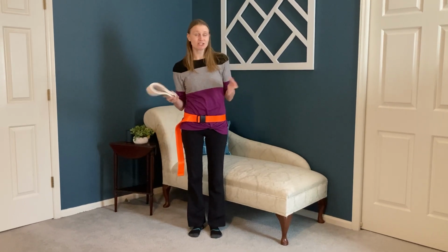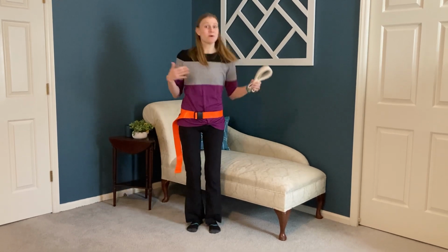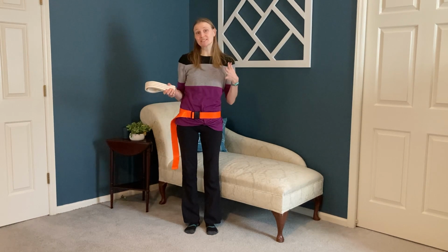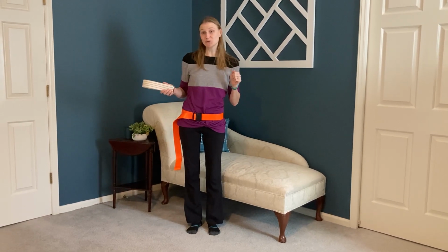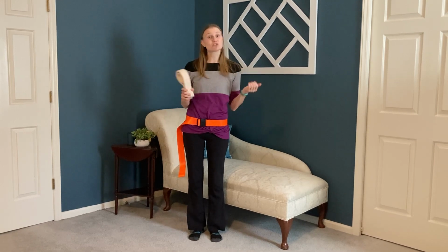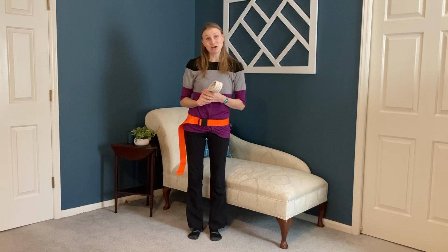Gait belts are essentially a belt that is designed to help with gait, or walking, or balance, or stability, and in some cases transfers. There are several different types of gait belts available to use, but the concept is the same. So I'm going to talk you through the concept, and then I will show you a few different options and how to best get them on, tighten them, and see how they work.